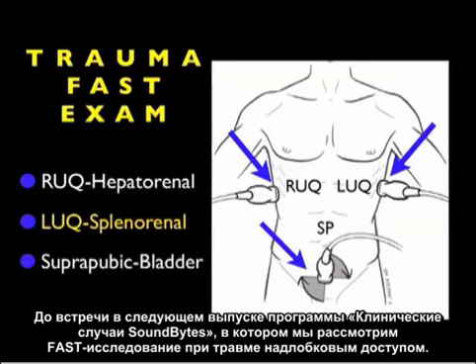So I hope to see you back as Soundbites continues and we move on to look at the suprapubic or bladder view of the trauma FAST exam.